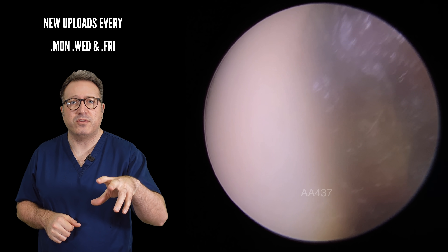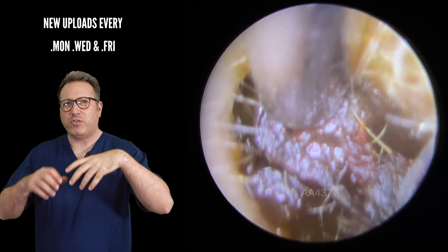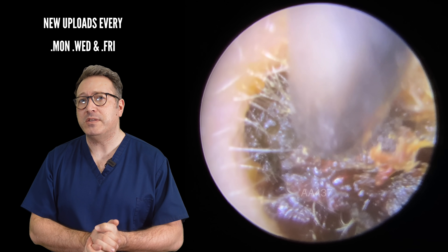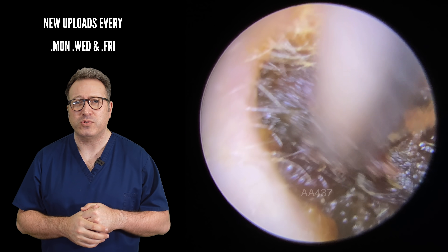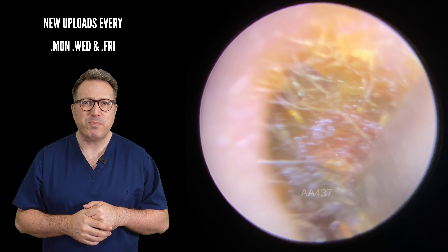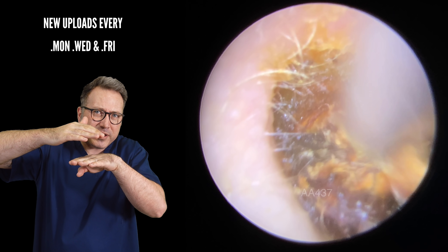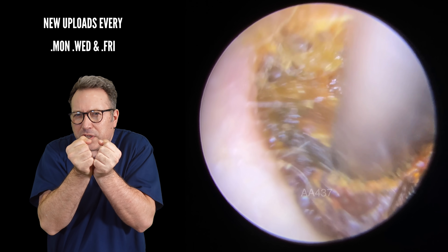Eardrum looking nice and healthy. In the second ear, we've got this really dry wax debris here as well. It's very dark in colour — in regular viewings we know that means it's a little bit older, and it does tend to dry out as it gets older. We're just going to start drawing this down from the top. As we pull down you can just see the separation between the wax and that little bit of dry skin just above it which is holding this in — the wax has dried around that piece of skin, holding it in really tightly.